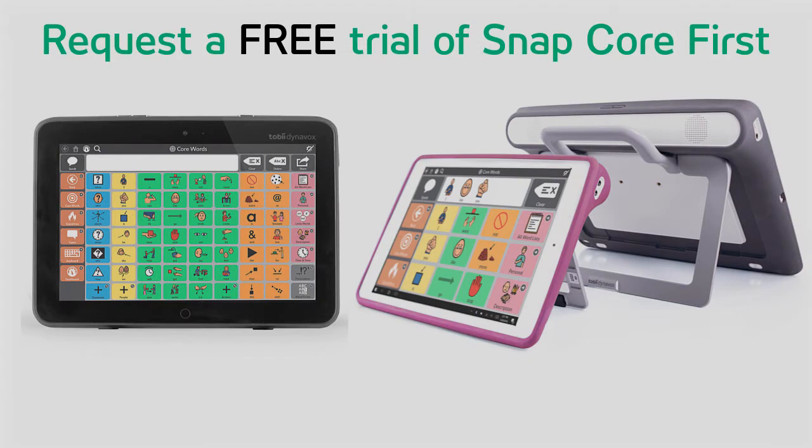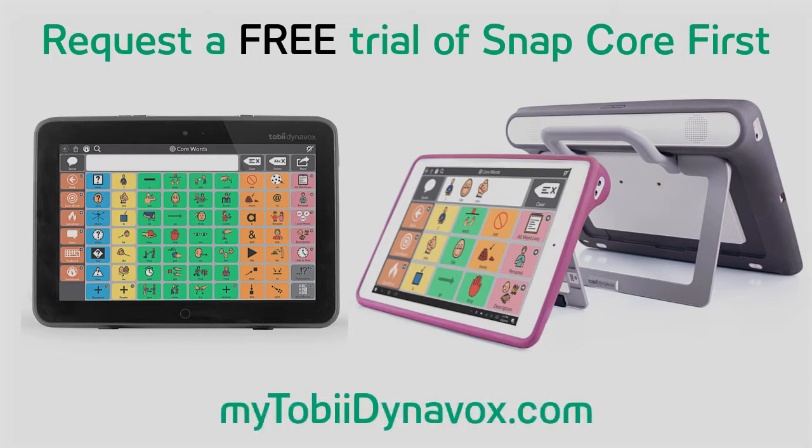Well, you can request a free trial version of SNAP Core First for any Windows device or for your iPad using a MyTobiDynavox account. This video will walk you through the process in order to request a free trial on a Windows device.